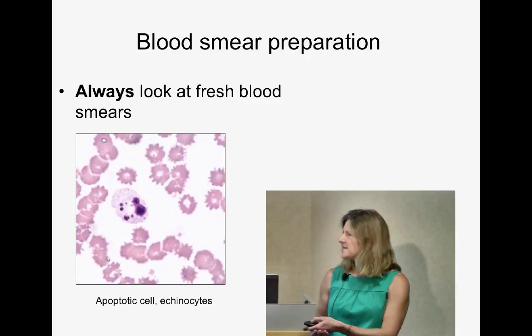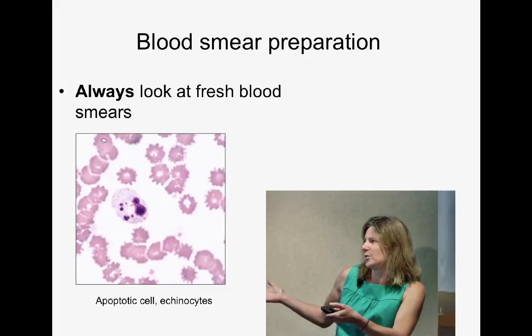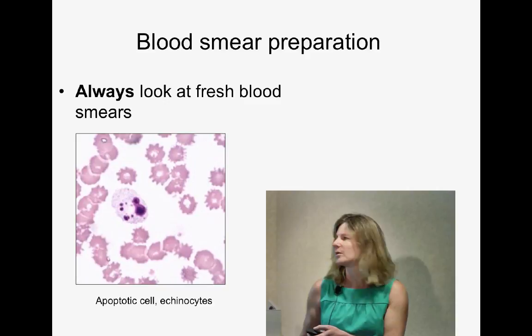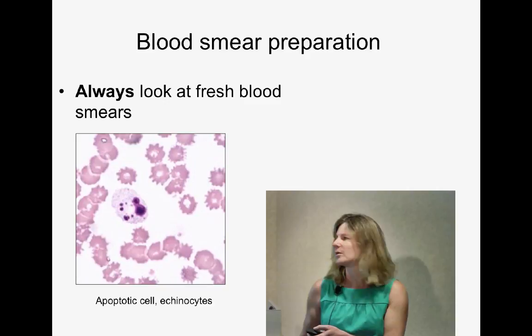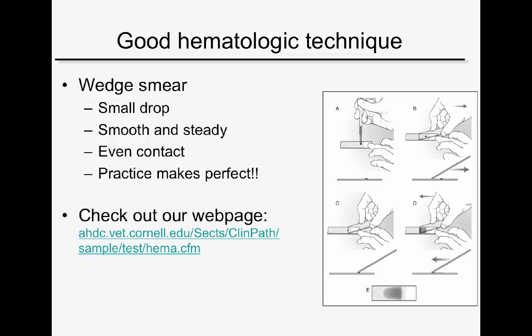Other things we see with storage are dead and dying cells. This apoptotic cell — probably a neutrophil based on its granules — is frequently mistaken for a nucleated red cell with a pyknotic nucleus. We also get echinocyte formation; this can occur pretty quickly, definitely within 24 hours, and is accelerated if the blood is not kept at four degrees.